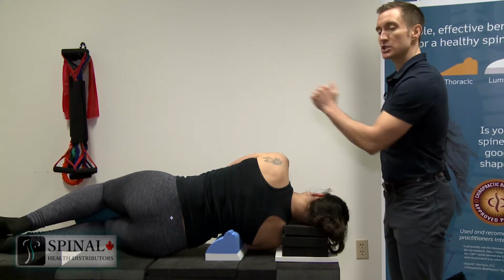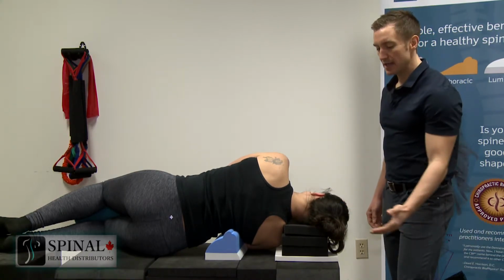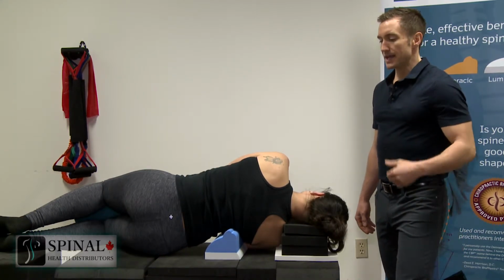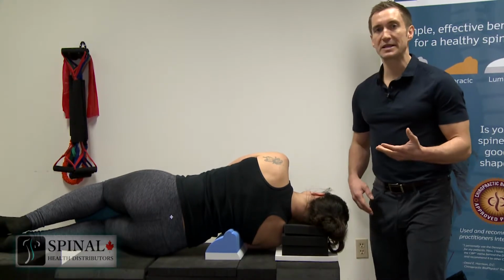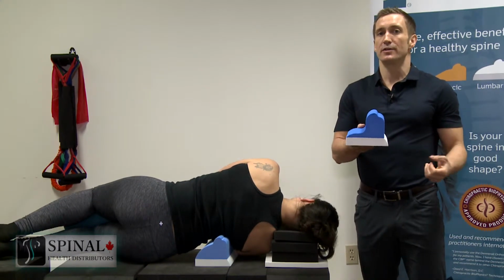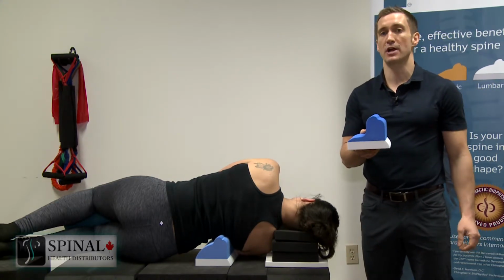We want to make sure that the patient is perpendicular to the table. We don't want to see any rotation in their spine. And again, we can see from behind, we're supporting the head in a fairly neutral position here. If the patient is sore while lying on the Scoliroll at first, we can cover the peak of the Scoliroll with a bath towel. I'll put a bath towel over top of the Scoliroll to ease the discomfort for the patient at first, or sometimes I'll even have them put an ice pack on top of the Scoliroll.